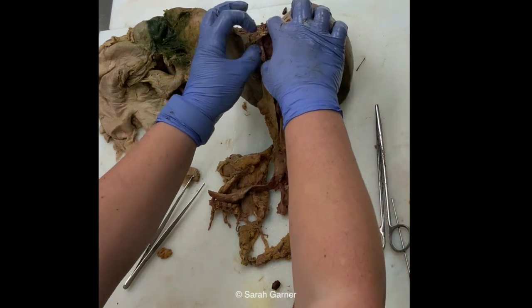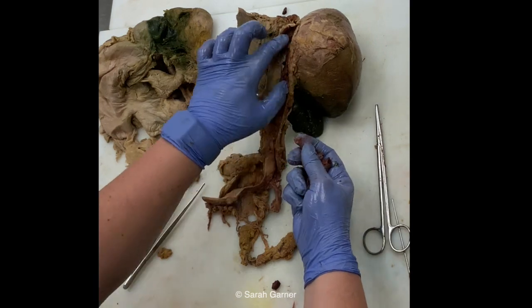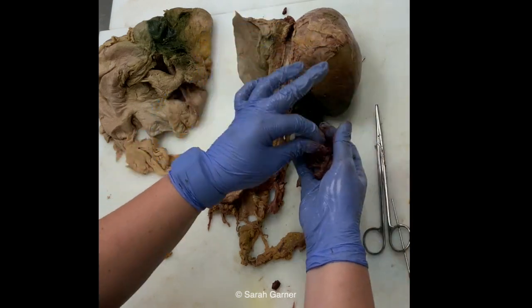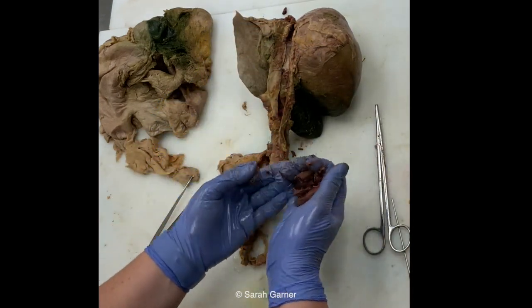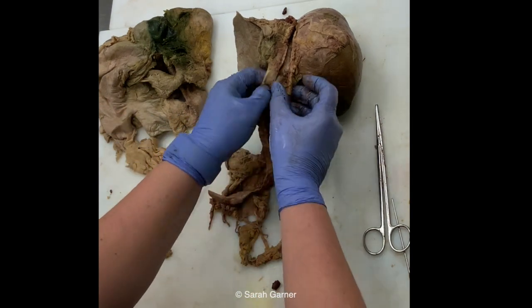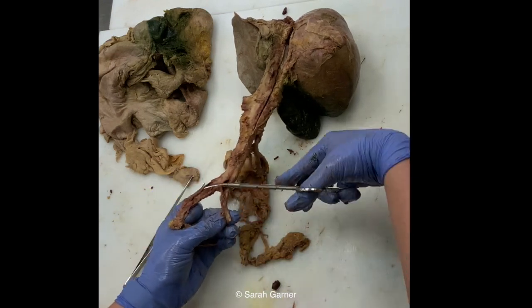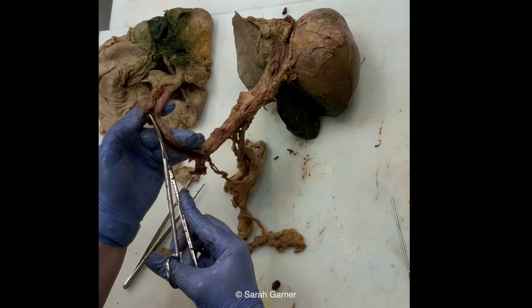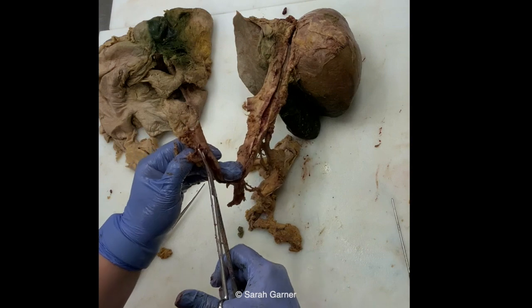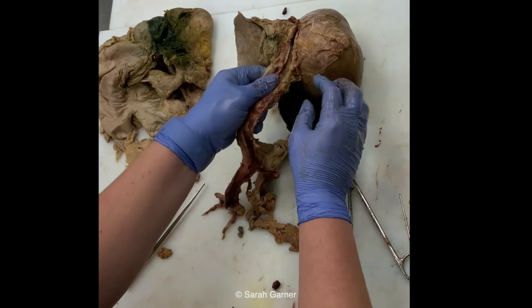And then it wouldn't normally be full of clotted blood like this. This is mainly because this is a fixed specimen. This would either be full of still liquid blood or would have already been drained a good bit because you've already cut so much and dissected so much. So you can open this up, see if you see anything abnormal. If there's a filter, you can note that. This is now your iliac vein down here, common, and now I'm getting into external. All of this, you can open it, inspect the inside. Note anything abnormal? Nothing abnormal.